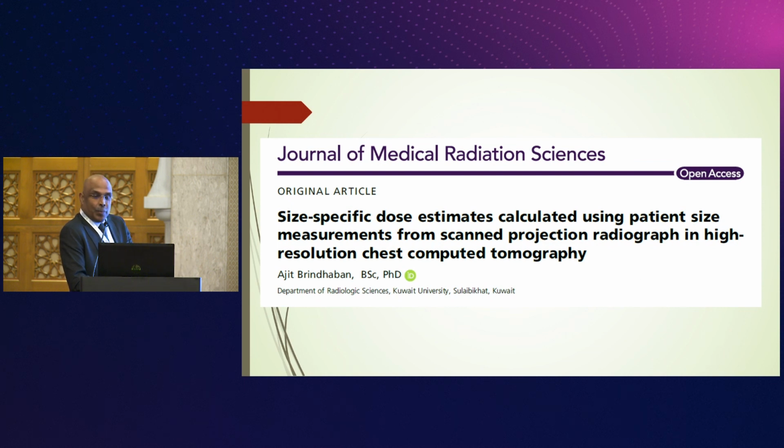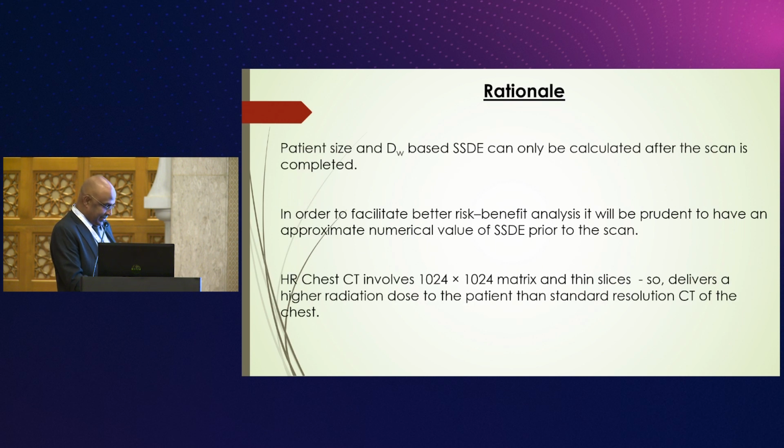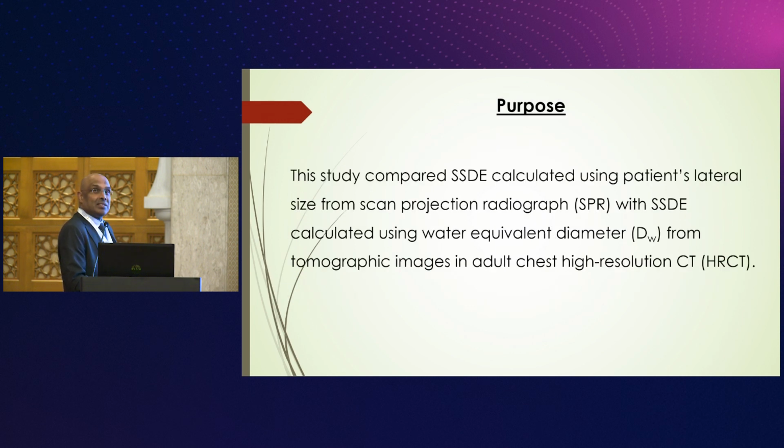So we thought, what if we compare the size-specific dose estimates from water equivalent diameter to size-specific dose estimates from either lateral width or AP size from your SCOUT view, because your SCOUT view is available before your scan is done, and therefore you can make an informed justification process. So the aim was to compare size-specific dose estimates from water equivalent diameter to size-specific dose estimates from SCOUT view measurements.